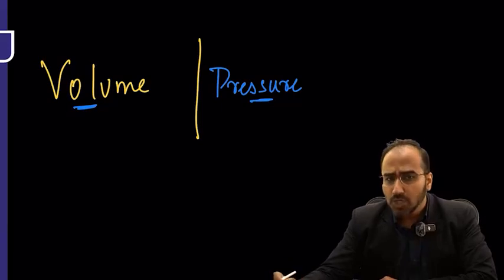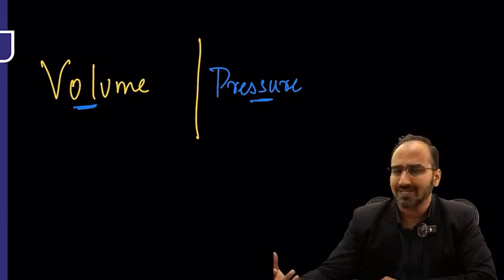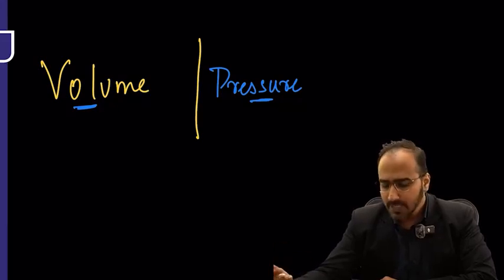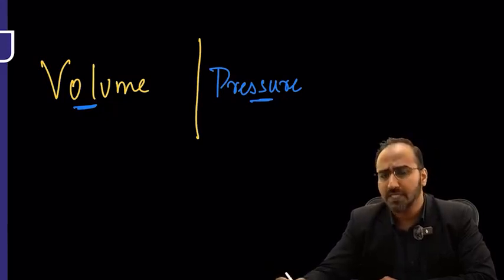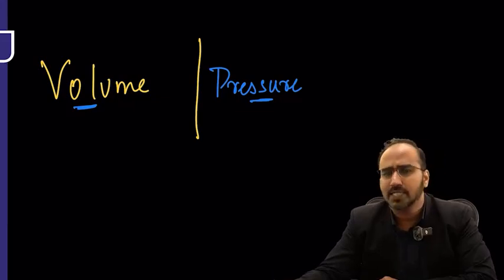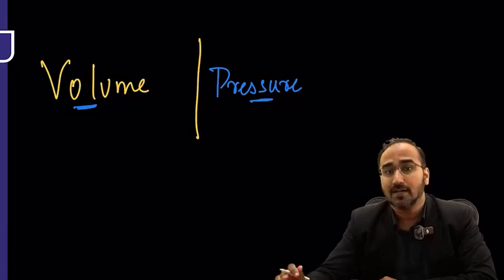Guys, remember, whenever you hear this term ventilator, you might be confused about how to set the ventilator, right? I'll just give you a brief review, because we have discussed it in detail in the full lecture. So look over here, guys. Ventilator is required for the patient who is not able to maintain saturation with a normal oxygen mask or other oxygen devices.